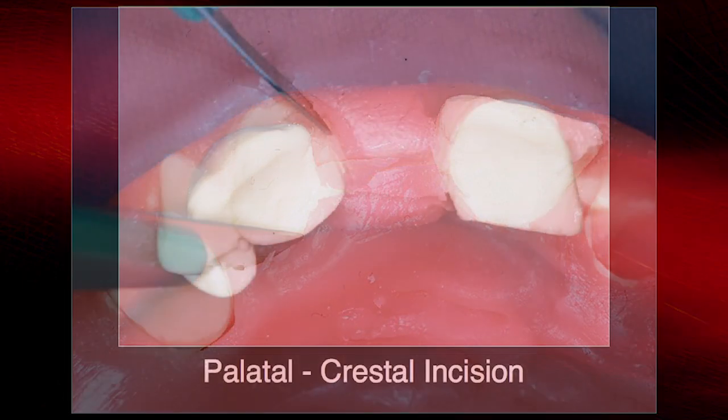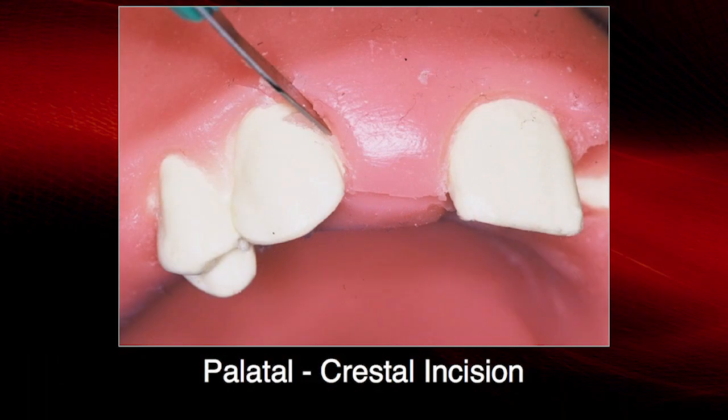of the bone. Now here, instead of going through and showing the U-shaped or the V-shaped design, here we're showing where we want to expose more of the bone.